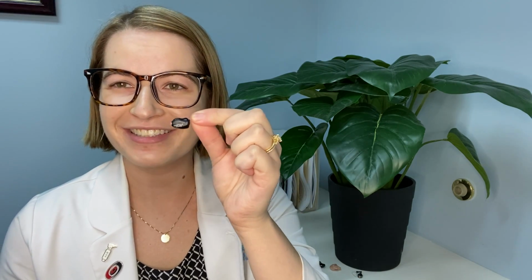Another popular style is the in-the-ear style, and this is a little itty-bitty one. The in-the-ear hearing aids are great, and they can be the right thing for some folks with the configuration of their hearing loss. If they have enough hearing loss in the low pitches, it can be a better fit for them. People who hear really well in the low pitches don't always like the sound quality of the in-the-ear hearing aids. And in-the-ear hearing aids come down to, what sorts of additional features do you need?